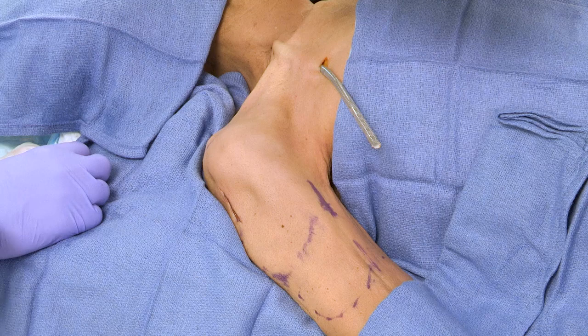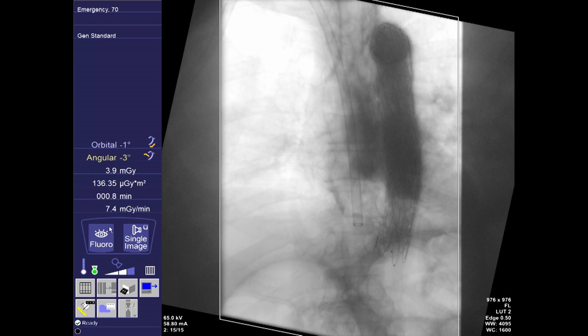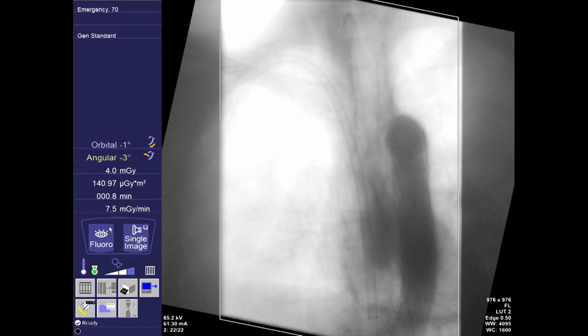Typically what we'll do is come down and first image where the distal end of that catheter is at. We can see the catheter terminates down in the low right atrium or at the atrial to inferior vena cava junction. Sometimes the catheters are completely malpositioned, going into the opposite brachiocephalic vein or somewhere else, so we want to make sure that we've got a good path down there.